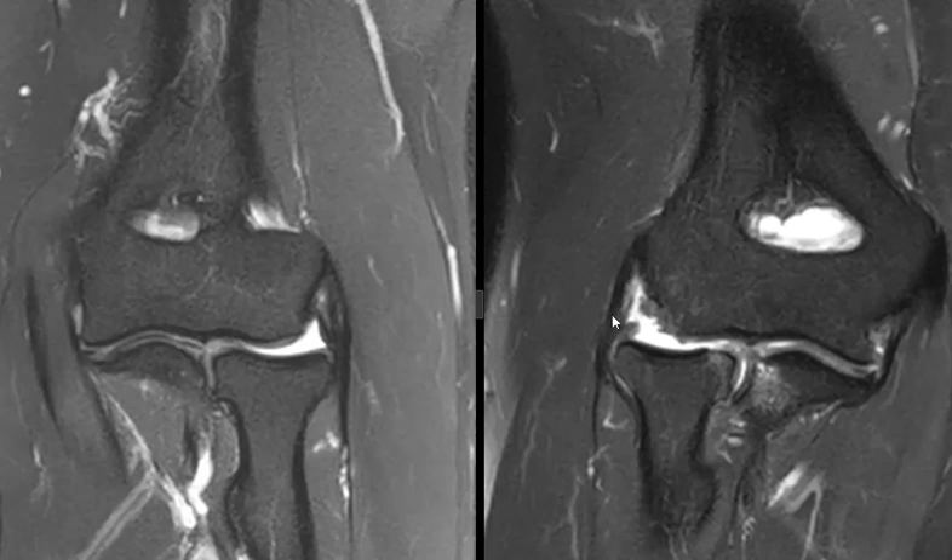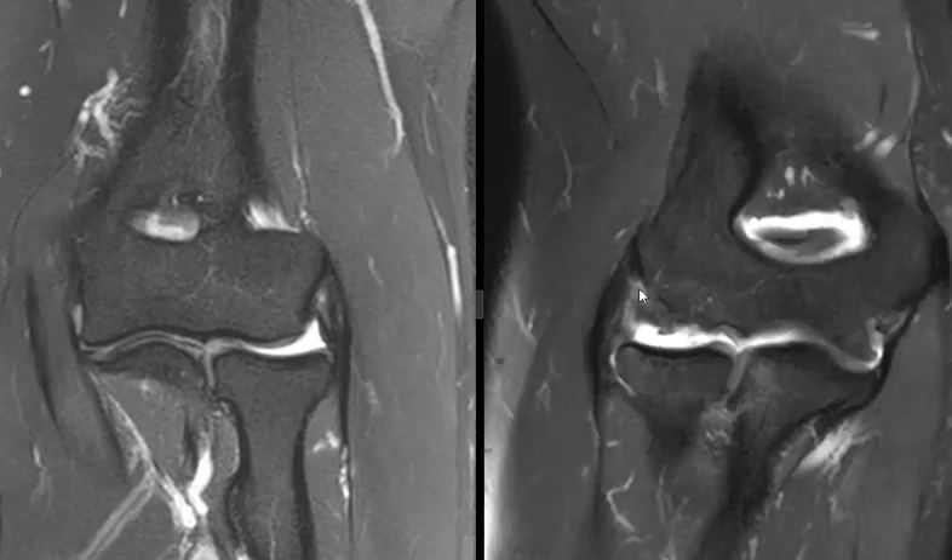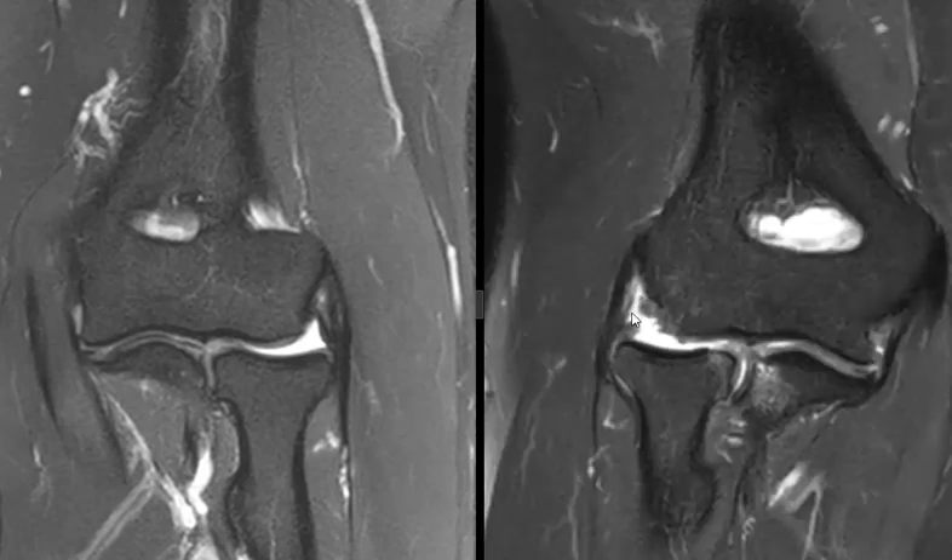The superficial fibers of the common extensor tendon — most of the bulk of those — are intact. So it really is a relatively isolated tear of the lateral ulnar collateral ligament and radial collateral ligament, with just partial thickness tearing of those undersurface fibers. That is it: a ruptured lateral ligament complex over here, and maybe a mild sprain on the other side. Thank you very much.